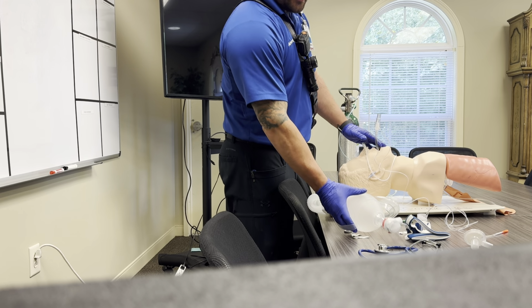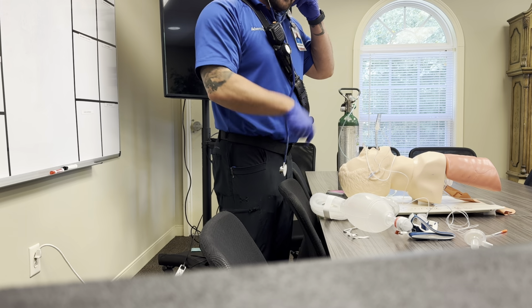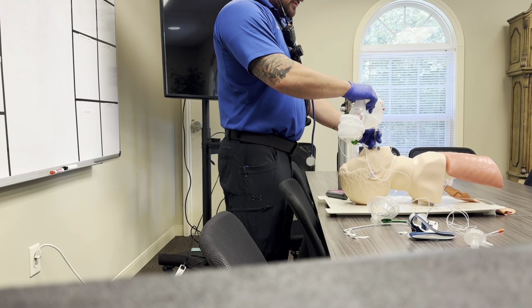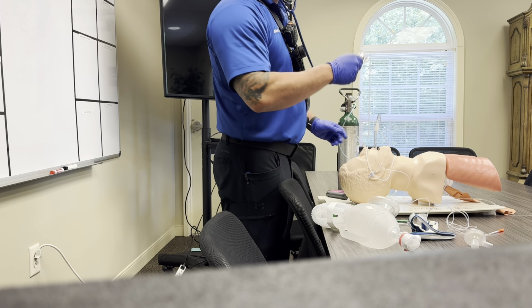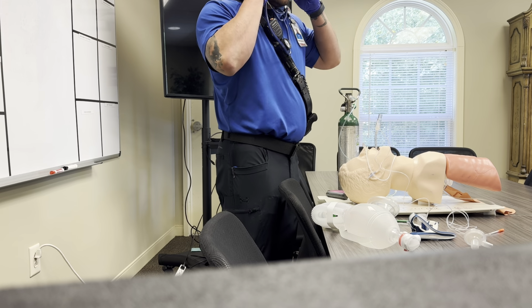And lastly, what we're gonna do, again, it makes it a little easier with the assistance from a partner, is place your stethoscope on. As your partner ventilates, you want to auscultate all the lobes of the lungs. Okay, so apex to apex, base to base, and everywhere in between.